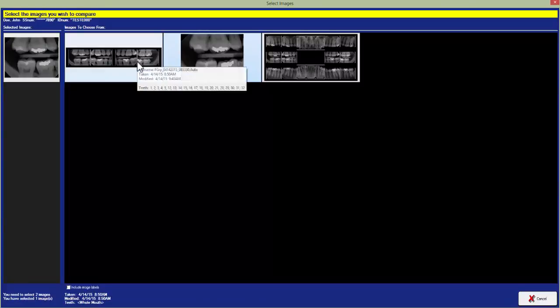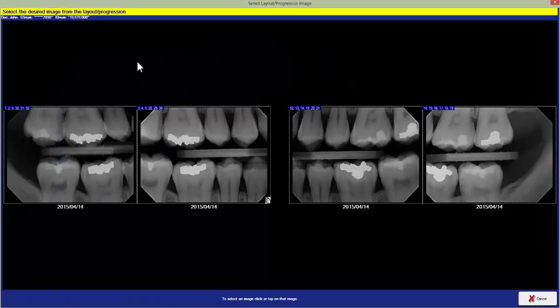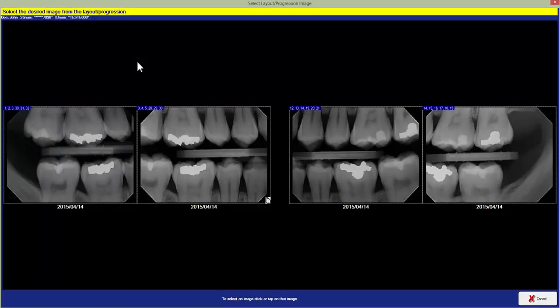To do so you just click on the layout and then click on the x-ray you want to compare.